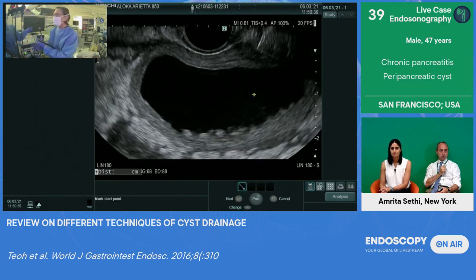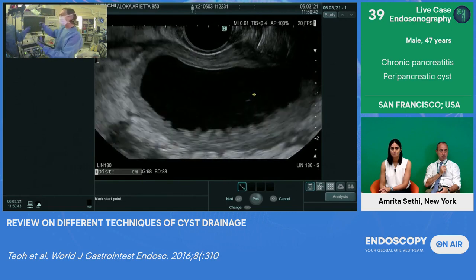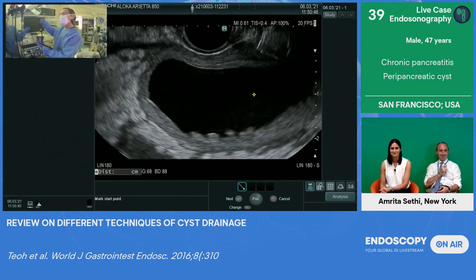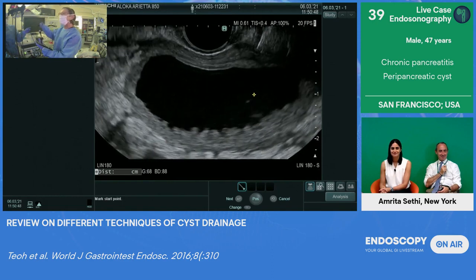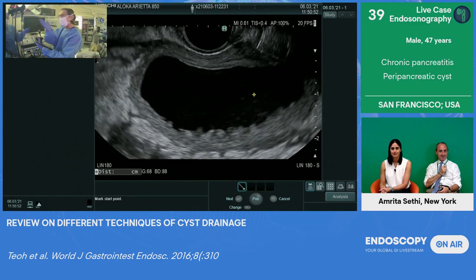And Courtney, my nurse, just told me that I'm hot. I like that. So that means cautery was just applied. She's going to disconnect that immediately after I'm in. But I'm in a good position now. I can see the sheath linear.